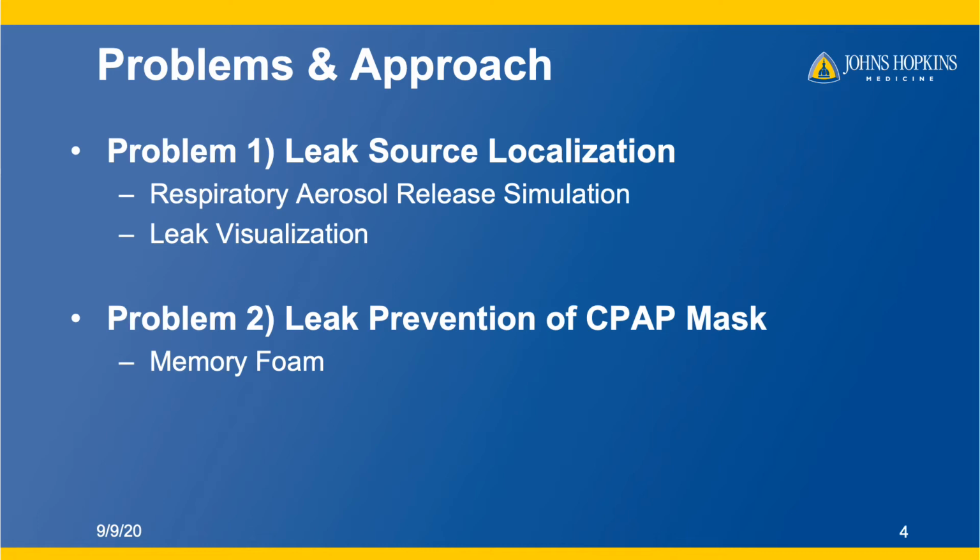Our second problem, which is the main objective of this study, is how can we then indeed prevent the leak from the CPAP mask? And we'll introduce a novel method of using a memory foam in subsequent slides.